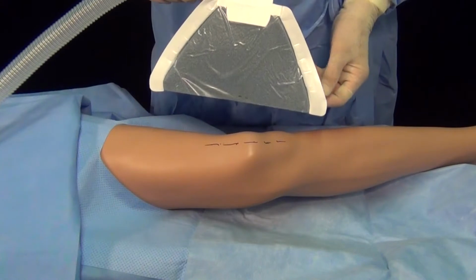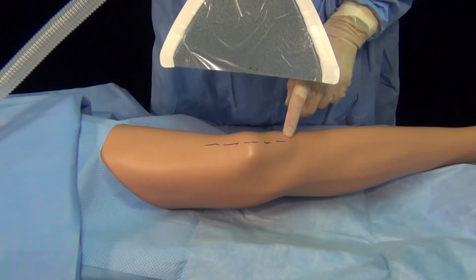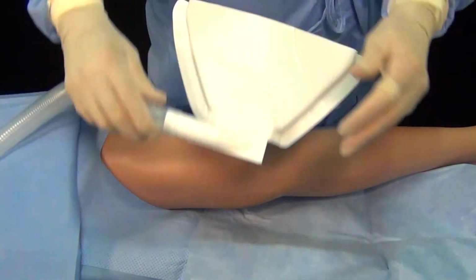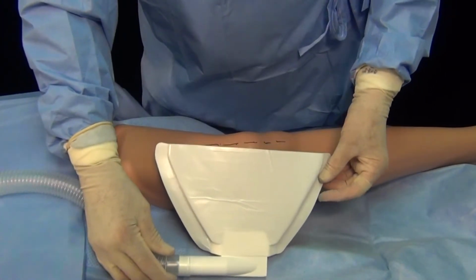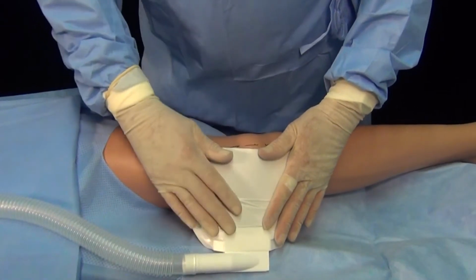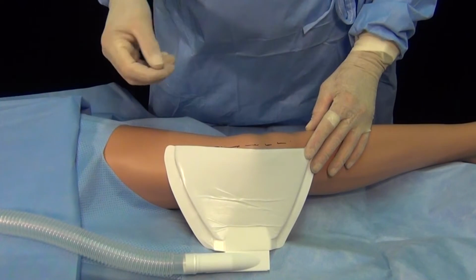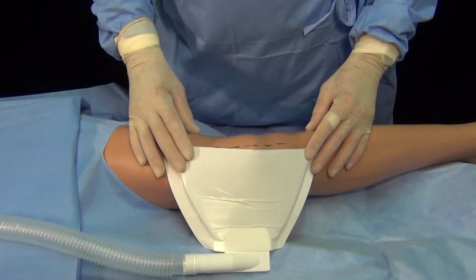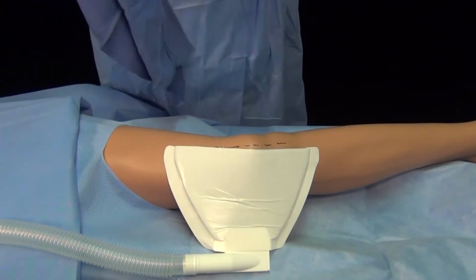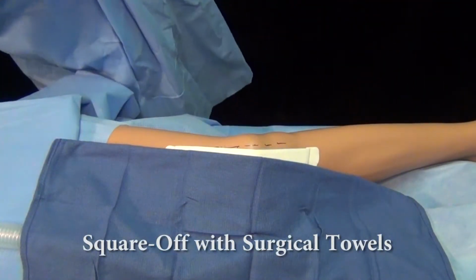For replacement knee surgery, where the incision is placed on the midline anterior over the knee, the device can be placed, we believe, most easily on the medial side, again, as close to the line of incision as possible. The adhesive is quite strong and will stay attached during the multiple flexing and extending of the knee that's required during the surgery. Once applied, once again you towel off.